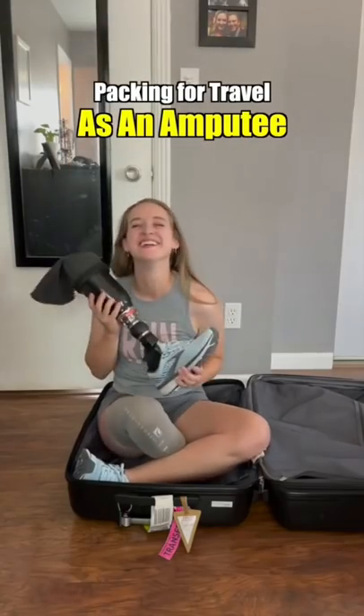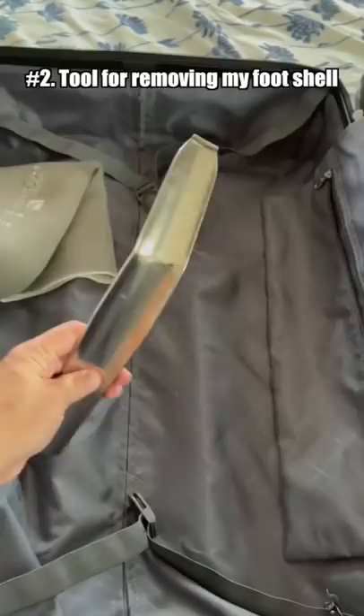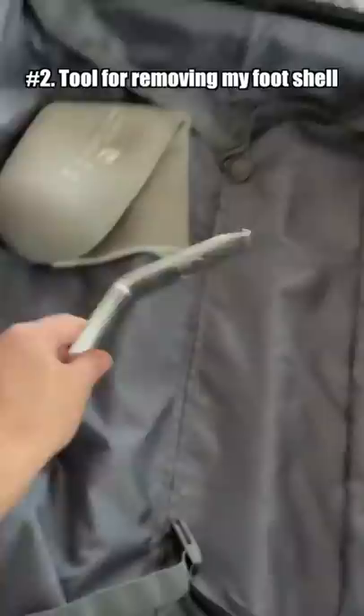This is what I pack when I travel as an amputee. It's really important that I bring a lot of extra parts and pieces in case anything happens. I start by bringing an extra sleeve, which is in contact with my leg. Then this is a piece that's built specifically for prosthetic feet to help get them off and empty them out of dirt and things like that.